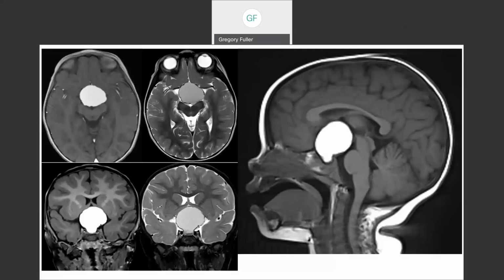Now, question, I thought that craniopharyngiomas, really of both subtypes, were heterogeneous, solid, and cystic. You know, big, irregular, kind of lobulated, some cystic parts, some solid parts, calcification. This is a cyst. It's one cyst. Right, a little bit lumpy, a little bit along some of the edges. It's monocystic craniopharyngioma. It's trying to mimic a Rathke cyst. Does that happen? Of course it happens.